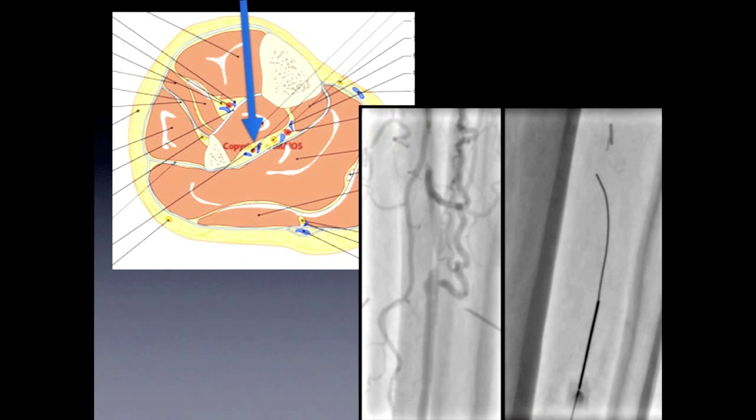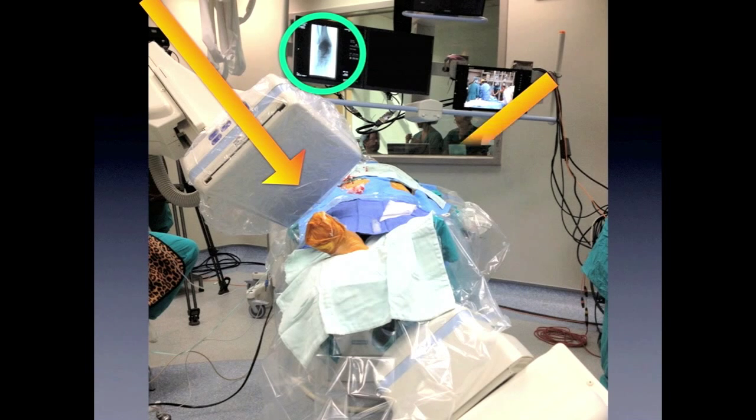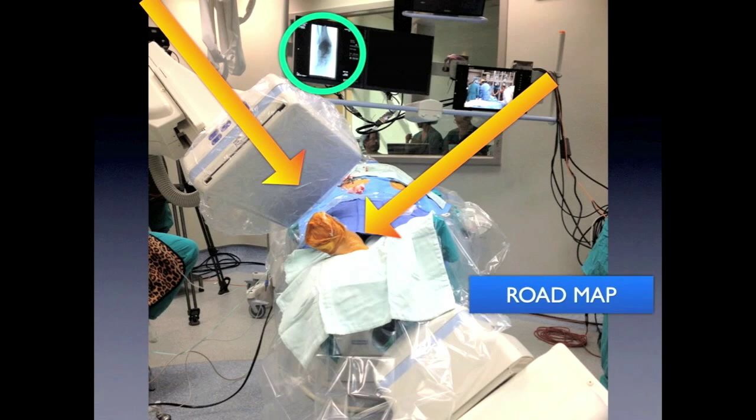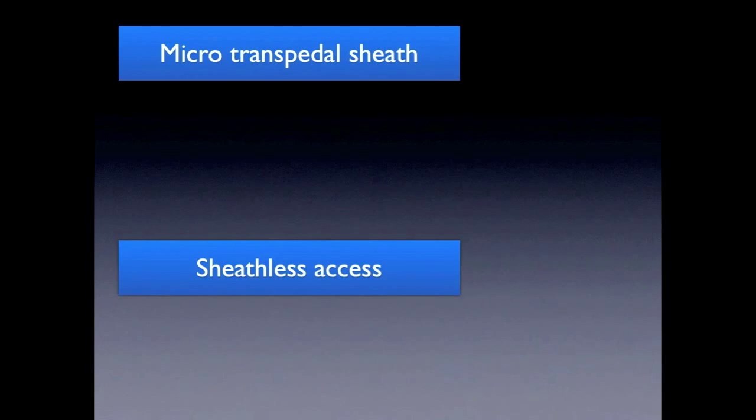So when you puncture down, make sure the needle comes at almost a 90-degree angle, or it's going to be hard to go through that. And yes, I do need to say: use clean and new needles — I've had this happen in the past in different countries. When you want to access that via fluoro, you have to take advantage of the fact that fluoroscopy will give you different angles of views, and ultimately you try to come at an angle that falls exactly on top of the artery you're accessing. The II in this specific case is aiming for a dorsalis pedis stick. You could use the calcium of the artery — which I call the calcium map — or use a road map, or eventually just a live shot.